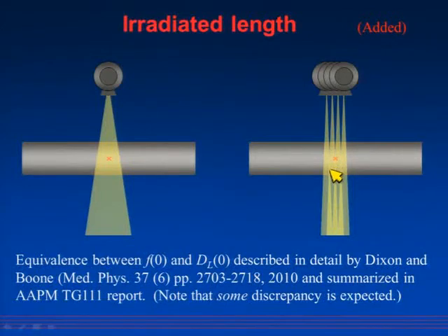What that also means is that CTDI, you get a number CTDI when you do a stationary table scan like interventional.